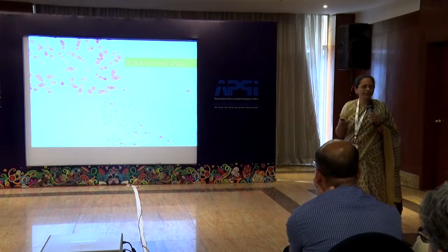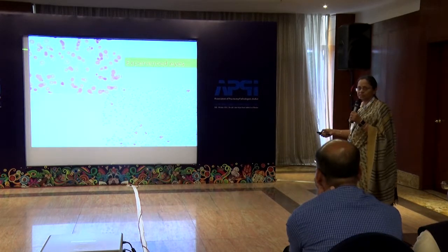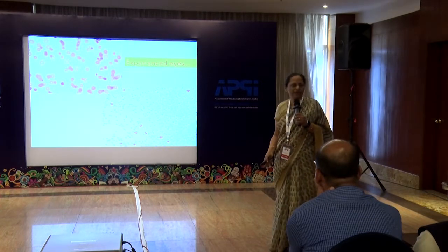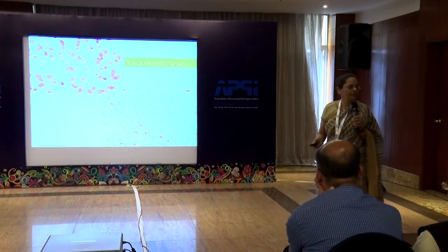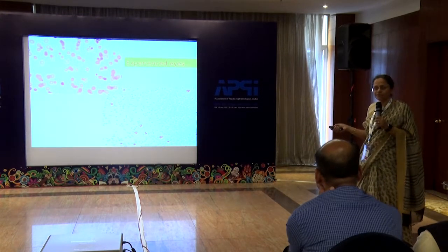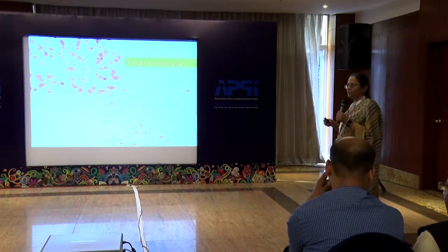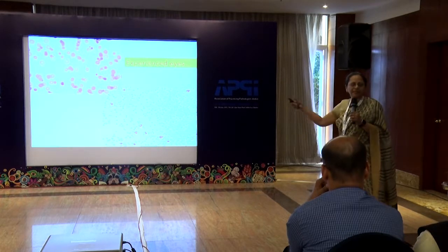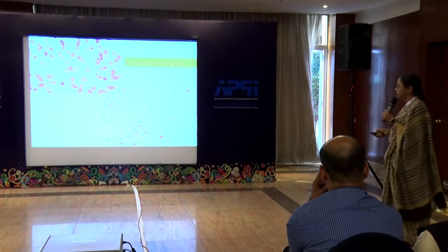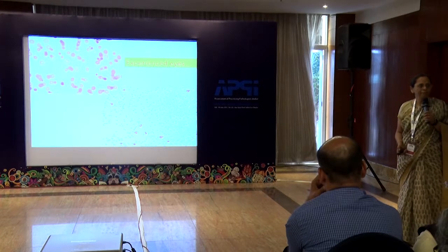To really differentiate. You agree that there are spherocytes, right? We picked up the spherocytes. So what will osmotic fragility do? It will just confirm that there are spherocytes. But what we want to know is not just that there are spherocytes. We've already seen them. We should ask for a Coombs test. So you already have skipped so many steps in the analysis and gone on to identifying what would help in arriving at a diagnosis. And if you saw this kind of smear, this picture, what would you ask for?